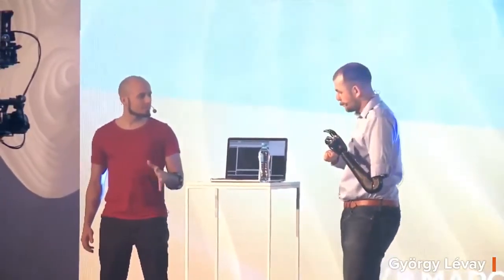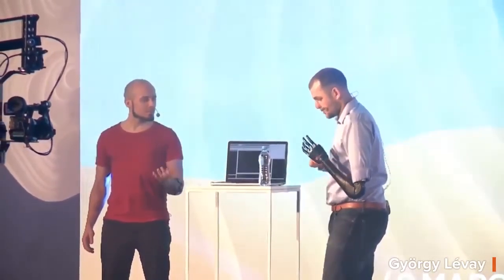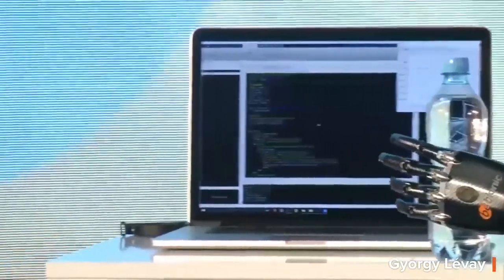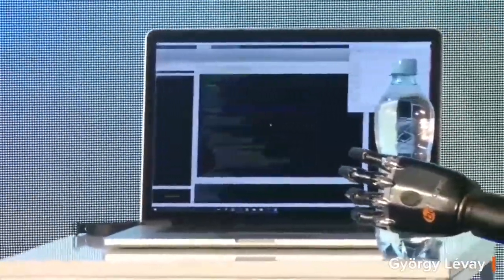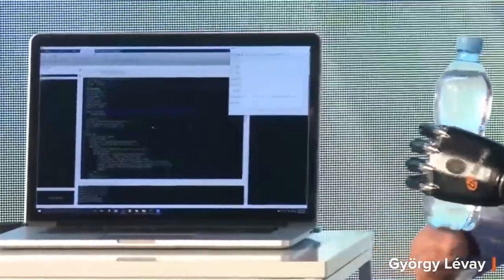Can you extend it, flex it? No, yeah, sorry, extend it, correct, yeah. Now rotate it a bit. Yeah, nice, nice. Okay, let's go. Can you extend it a bit? Yeah, perfect. Now close. Oh, that's great. I'm going to put this under here.